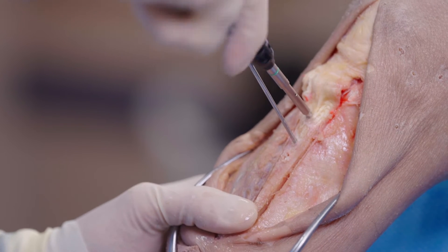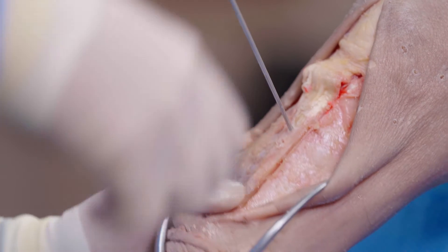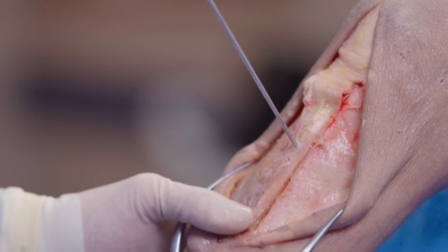Sometimes you're going to find a little periosteum or a little tendon distally — that's okay. It's a very wide footprint. So now we're going to actually drill.